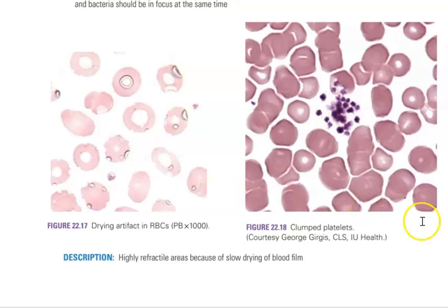Now let's look over at figure 22.18, and we're looking at a clump of platelets right here in the center. A clump of platelets can be a problem for a patient sample, because on an automated hematology analyzer, this clump of platelets can register as other types of cells, making your counts inaccurate. So if you have a lot of platelet clumps in a sample, you may have to call and get a redraw on a patient, because you don't want your counts to be inaccurate. So that's something to look for, but a platelet clump would be considered an artifact.